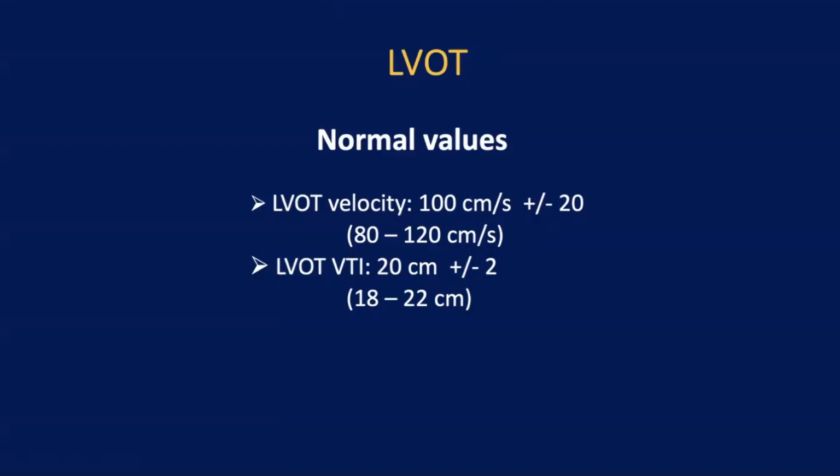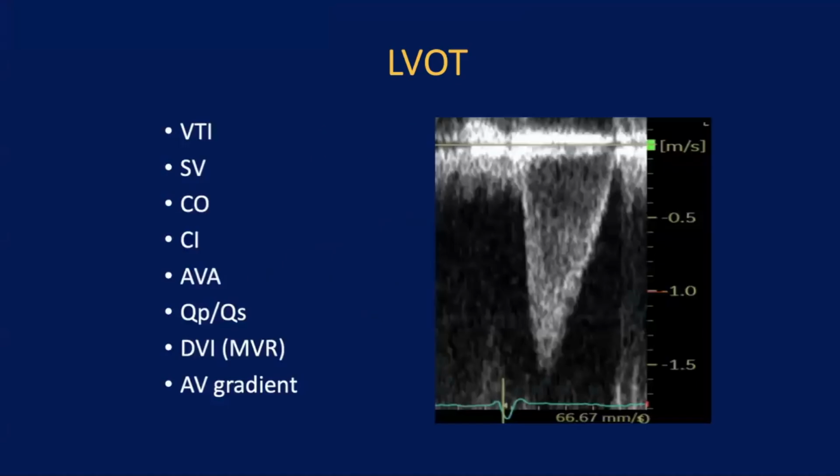So I calculated her cardiac output. It came to 10 liters per minute. So she was having hyperthyroidism and high cardiac output failure. Because the signal is high, why is she complaining of shortness of breath? Shortness of breath because of high cardiac output, not because of low cardiac output. What is the thing that we can use? We can know just by the VTI.